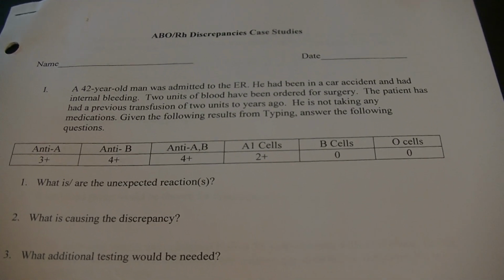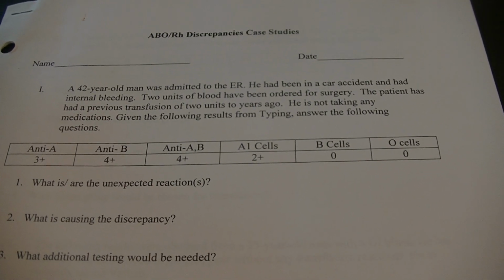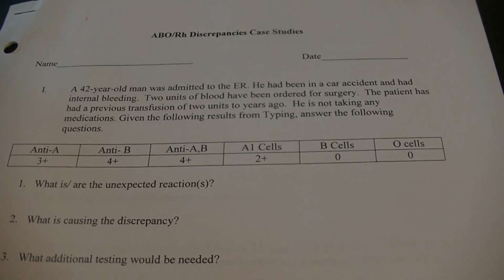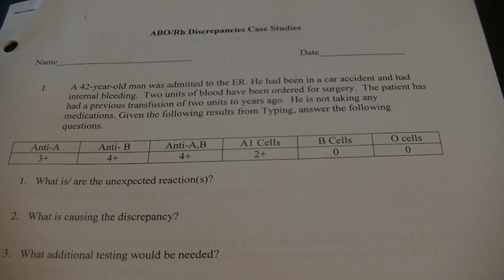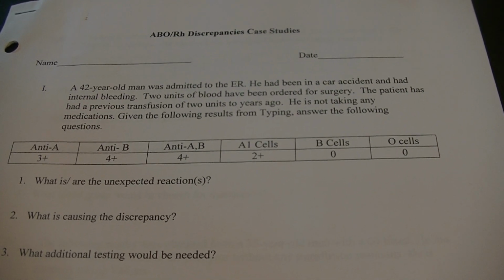On the reverse typing or reverse grouping, our A cells have a 2+ reaction and our B cells do not have a reaction. We expect there to be no reaction with A cells or B cells in a person who is AB type blood because you only make antibodies to the antigens you lack.